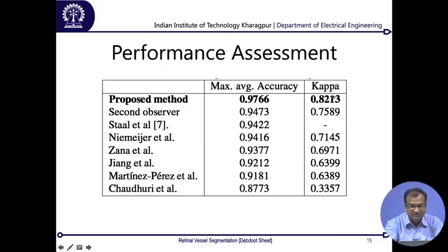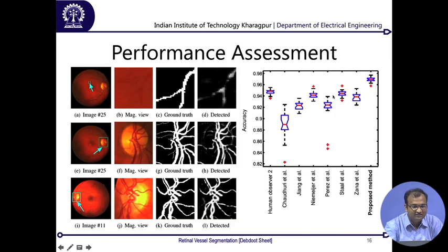Now coming to a more critical evaluation of the different stages, this is what I have here. This is the main image, on which this small cyan colored square points to the zone which is magnified and shown here. On this, it's really hard to find where the vessel is, and since I know where it is, it is somewhere over here. The ground truth also marks it somewhere over here, but with a naive eye there is a high chance that you would miss where the vessel is located in this small region. Whereas using these kinds of methods, you are able to predict it quite effectively.